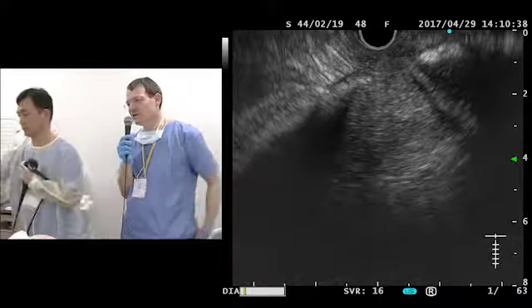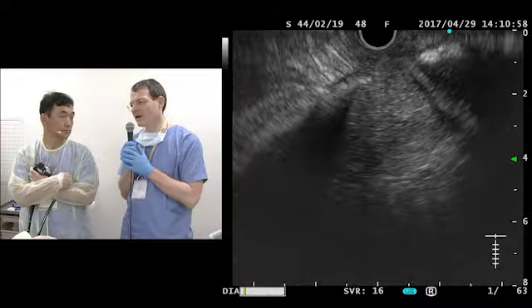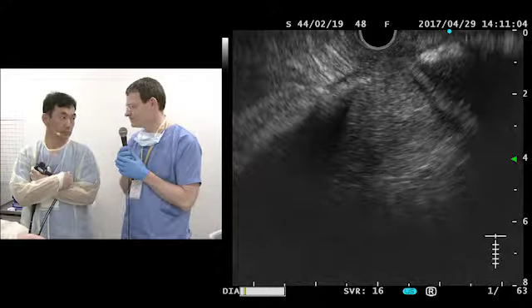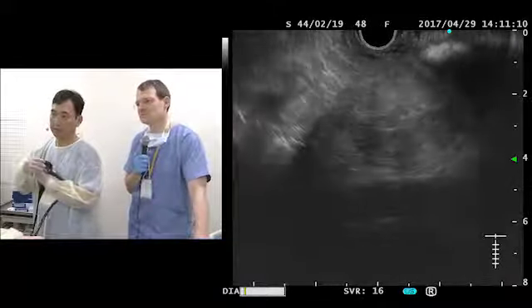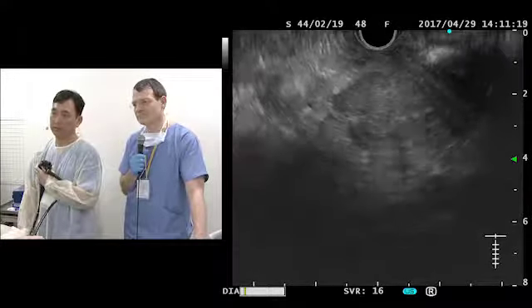I think this is a very important point also, that these features may also be part of a focal pancreatitis. But for sure, this situation we have to count as a suspicious lesion. Right, for the moment. So as clearly stated by Stefan, we have some suspicion of a possibly benign process here, but fine needle aspiration would be the proper thing to do.